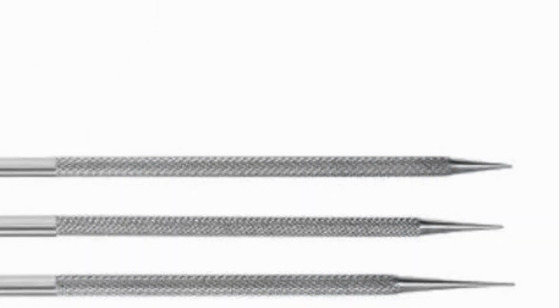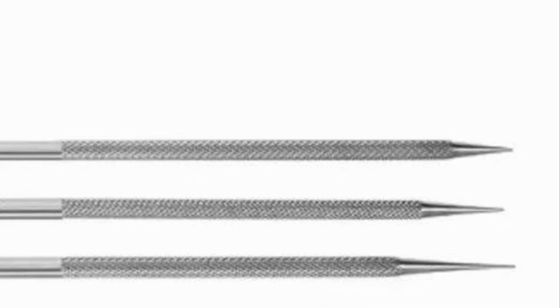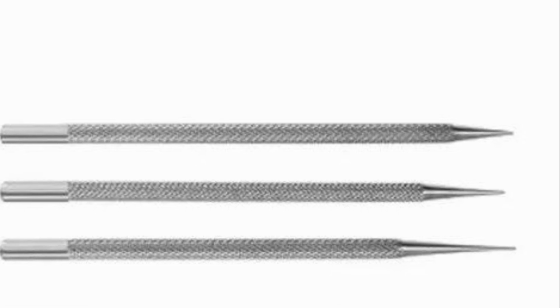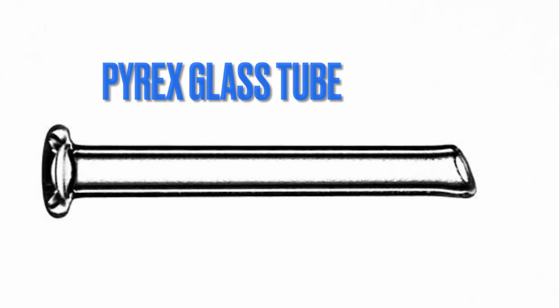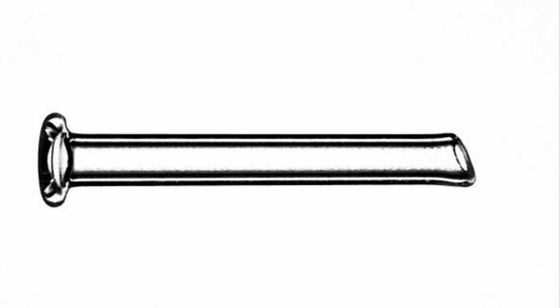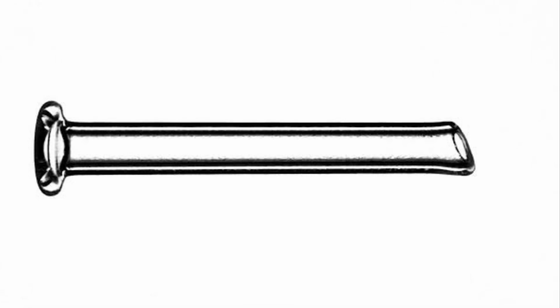After establishing a conduit from the medial conjunctiva to the nasal cavity, the next step involves the use of lacrimal dilators to expand the newly created tract. This process ensures that the pathway is adequately sized to accommodate the Jones tube. The Jones tube is then carefully passed through the established tunnel, ensuring that its distal end extends at least 2 millimeters beyond the lateral nasal wall into the nasal cavity.